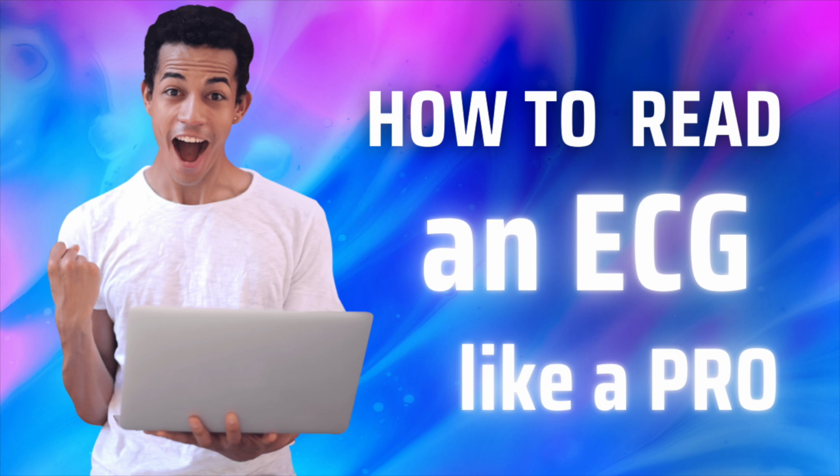Exactly. And it can be tough to tell the difference between that and true ST elevation, which is a big deal, of course. So how do we avoid freaking out over nothing? What's the key to figuring out if it's a harmless quirk or something serious? We've got to play detective, look at the whole case file: the patient's age, what symptoms they're having, their medical history, all the clues. Benign early repolarization, this high takeoff thing, usually happens in younger, healthy folks, and it often shows up in multiple leads, in specific patterns.